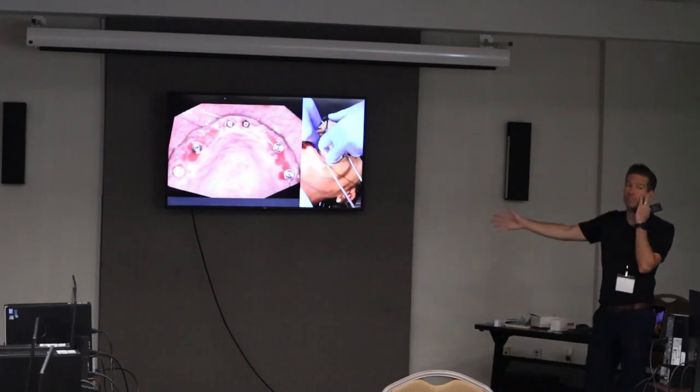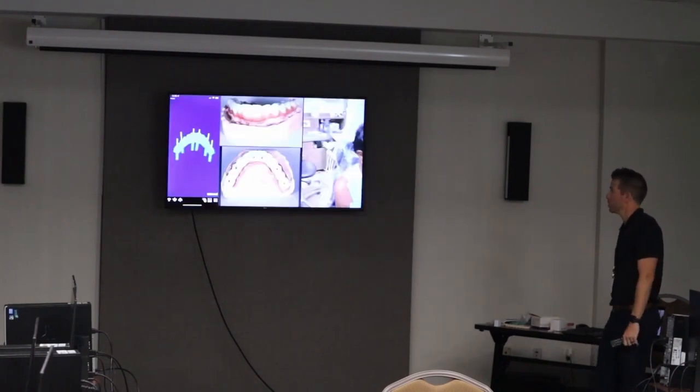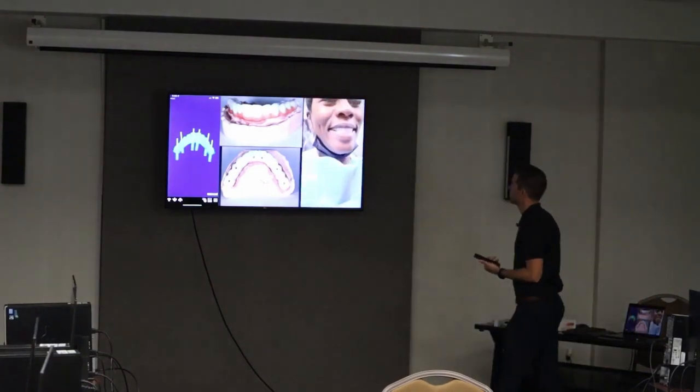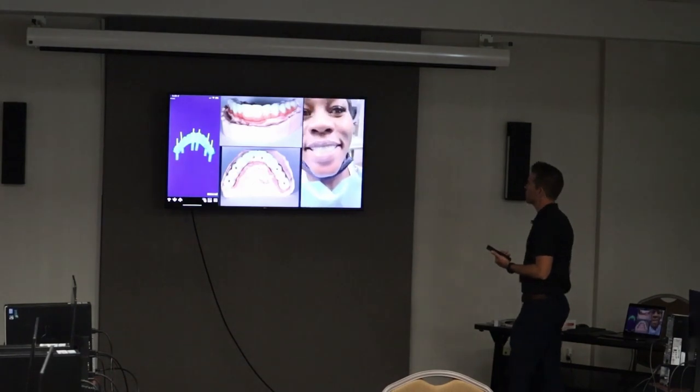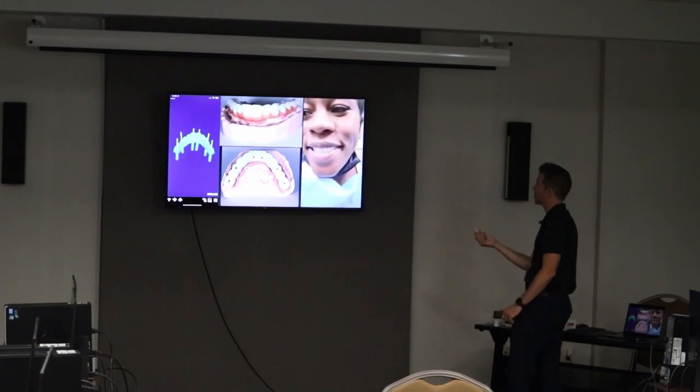Really simple to do — this case was very predictable. All this stuff goes to the lab digitally; here's the ExoCAD design. This was the second temporary — this is the one you guys are actually going to get to hold.